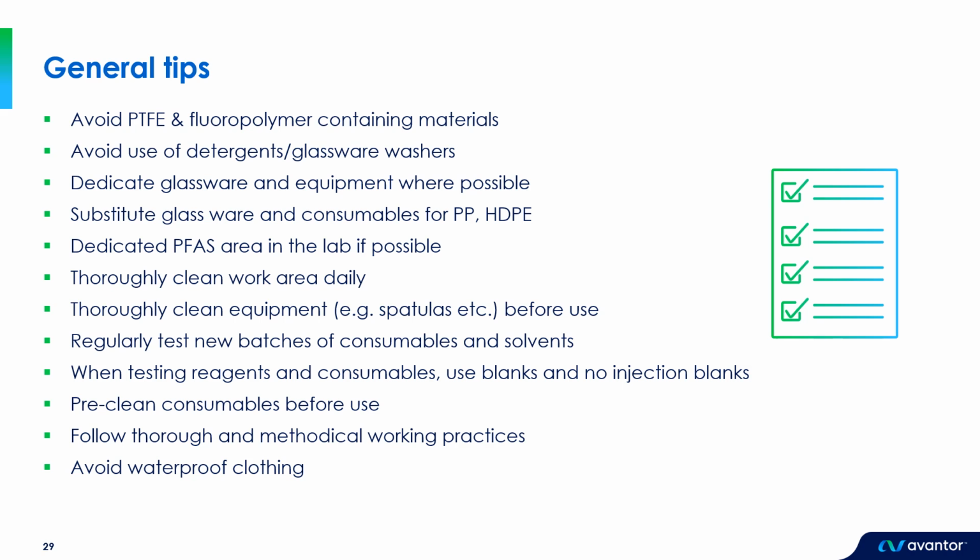I tend to pre-clean things like sample reservoirs, sampling bottles. For consumables like vials and pipette tips, we need to test them to find ones that are suitable for use. And we can potentially avoid the need to pre-clean items like that, but I certainly know that some do take the approach of pre-cleaning all consumables with an organic solvent before they're used for PFAS analysis. And the key here really is to identify what process works for your specific lab.